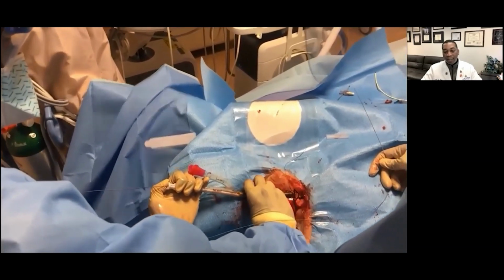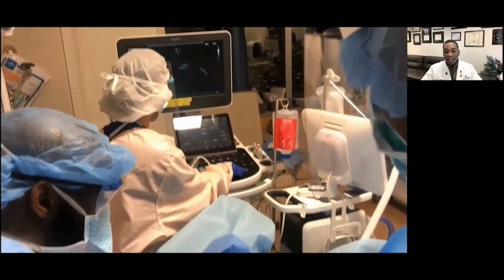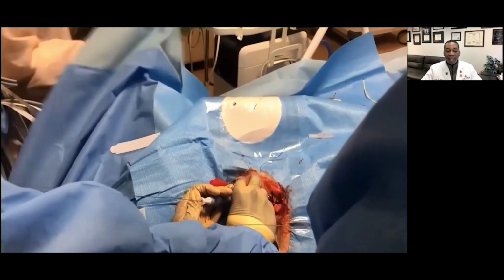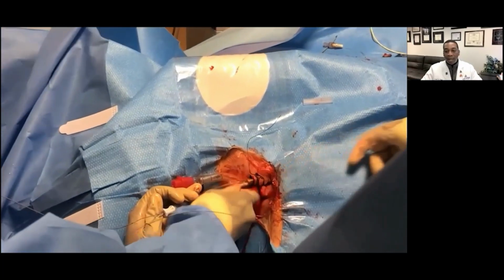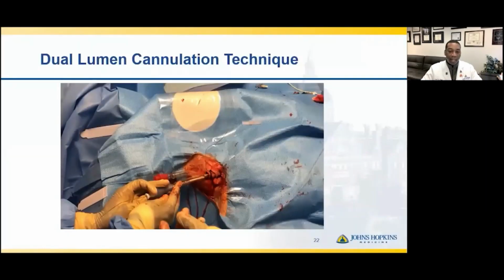And you see that this is really a controlled deployment technique, but that it can be expediently deployed, so that we find, again, that dual lumen cannulation can be just as fast as single lumen cannulation techniques, especially since you only need to insert in one spot. And our preference is to insert the cannula all the way to the hub of the cannula, which is noted by that suture, the gold suture collar, because once we remove the guide wire and go on ECMO connected to the circuit, then we can retract the cannula under TEE guidance to make sure that the atrial infusion jet is in the appropriate position.